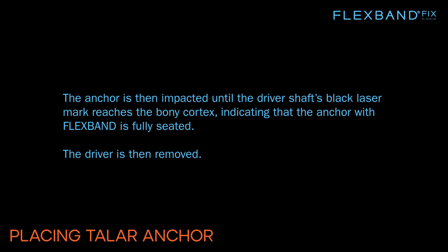The anchor is then impacted until the driver shaft's black laser mark reaches the bony cortex, indicating that the anchor with FlexBand is fully seated. The driver is then removed.